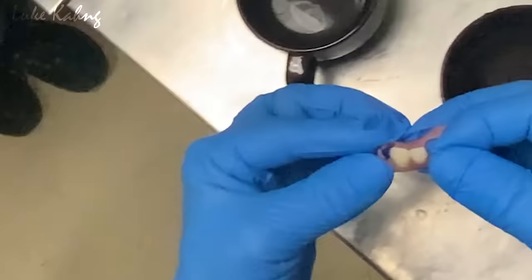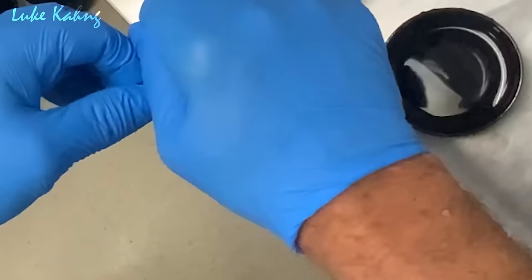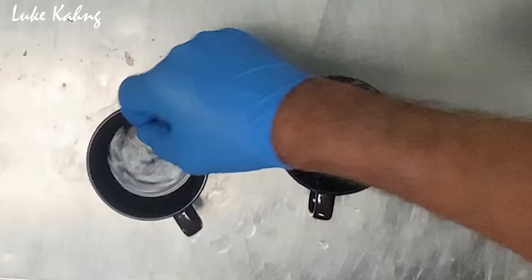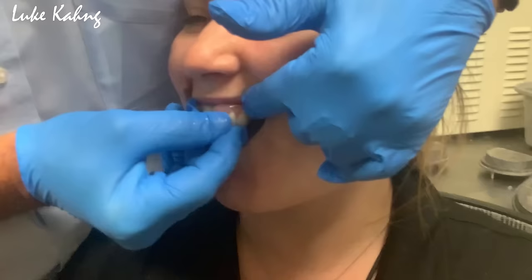Best thing is to put it under tap water. It makes it easier. 30 seconds? Yeah, about 30 seconds. This is going to be very tight. Now, if it's over tight, you can do the same thing, but go reverse if it's too tight. We're going to tighten both sides up. And then this, you bend it in. You place it under cold water just for a couple seconds. And then you go ahead and try it in the mouth. I want it to kind of snap in, if possible. And sometimes we have to put a little bit of pressure. Yes.